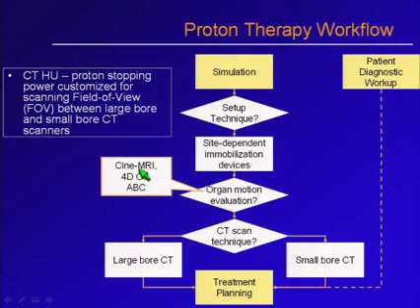You're going to use Cine-MR to get a patient-specific motion model, because you cannot really apply the population-based patient motion models as we do in conventional radiation therapy, because the effect of protons, as I said the other day, Monday morning, was almost a binary effect, so patients can be affected differently. So you really need to be looking at a patient individually.